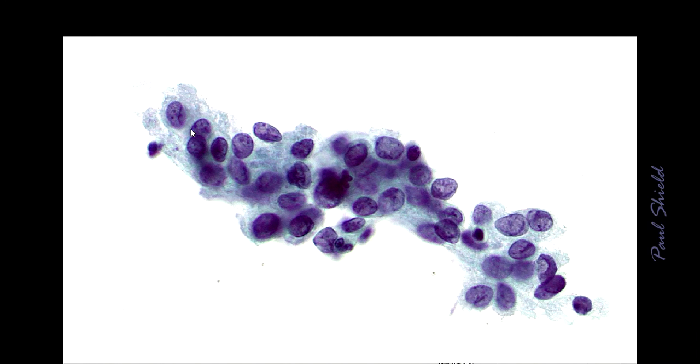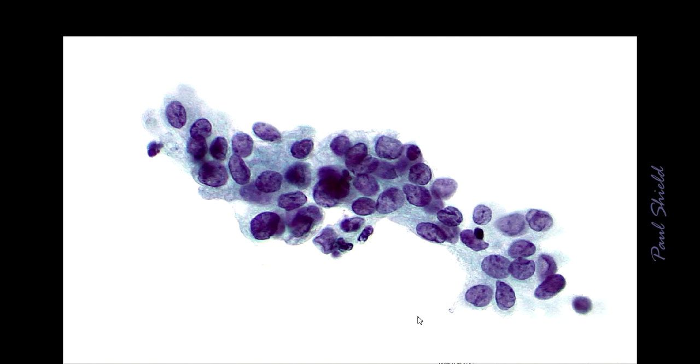Most of them, that one there is fairly oval, but a lot of them are more teardrop shaped, like that one. And they have coarse but even chromatin. So these are high SIL in what I would call a loose sheet. It's only maybe 2 cells deep at the most.